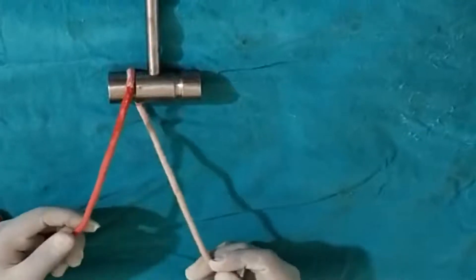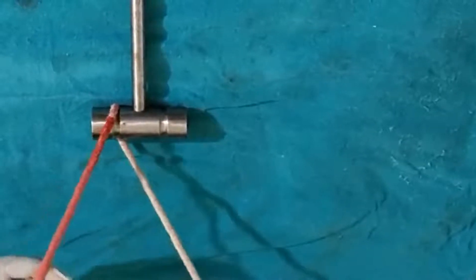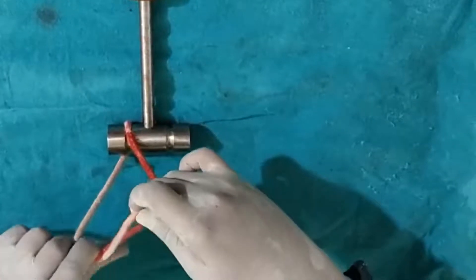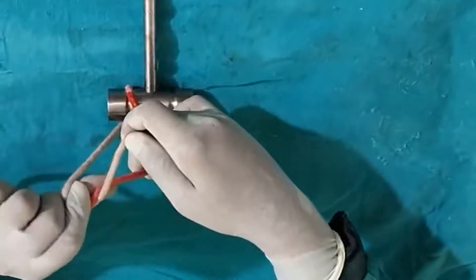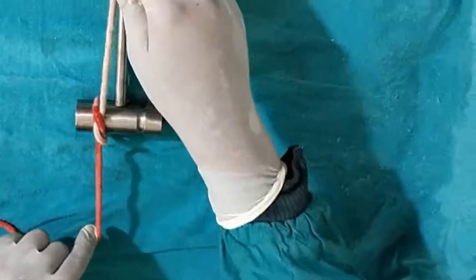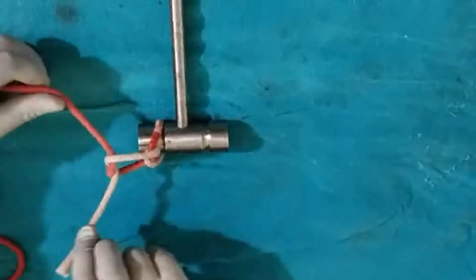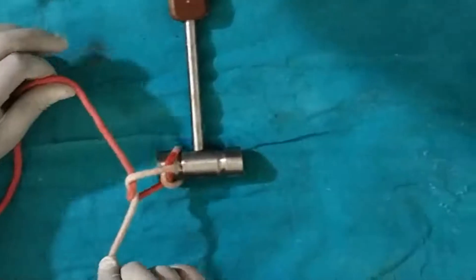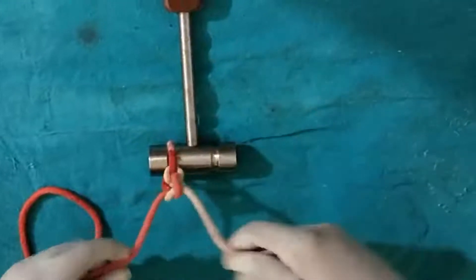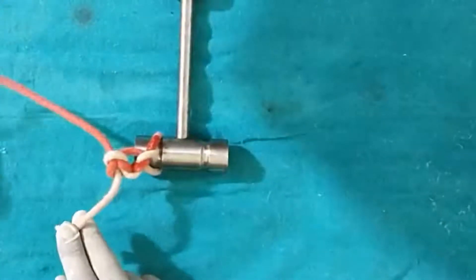For the two-hand tie, both hands are engaged in putting the knot. You just hold like this, make a loop, then put the thumb at the junction and with the index finger pass the free end through like this. For the second throw, use the thumb to pass. You can see this is again a square knot, not a granny knot. In this way you can put the double-hand tie.